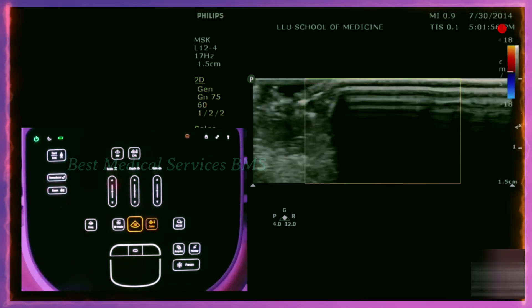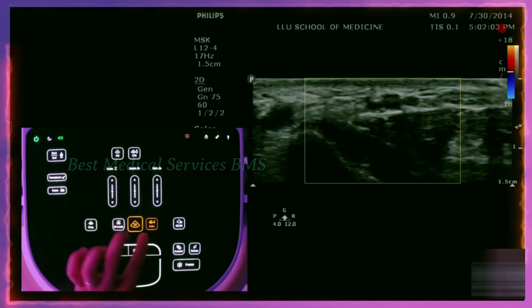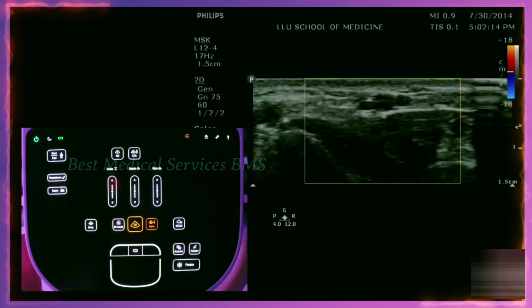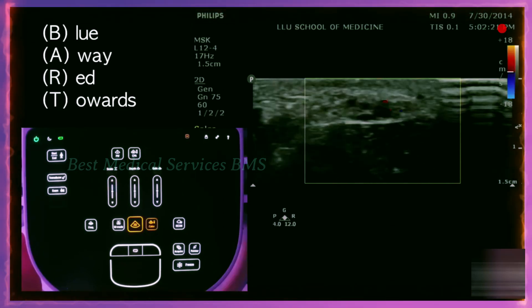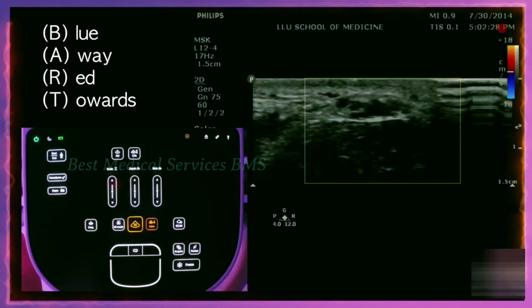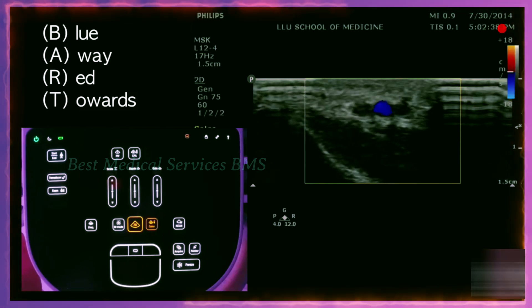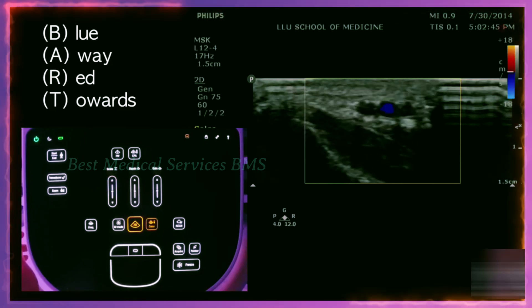Another important topic is color flow Doppler. You push the color flow button on the top right of the screen and that will turn on the color flow Doppler. Red means towards the probe and blue means away from the probe — the concept is called BART: Blue Away, Red Towards. Here I'll tilt my probe so blood goes towards it — you can see the flow is red. Now I'll shift the angle so blood flows away from the probe — now it's blue. Remember that red does not mean artery and blue does not mean vein; it just means the direction of blood flow relative to your probe.